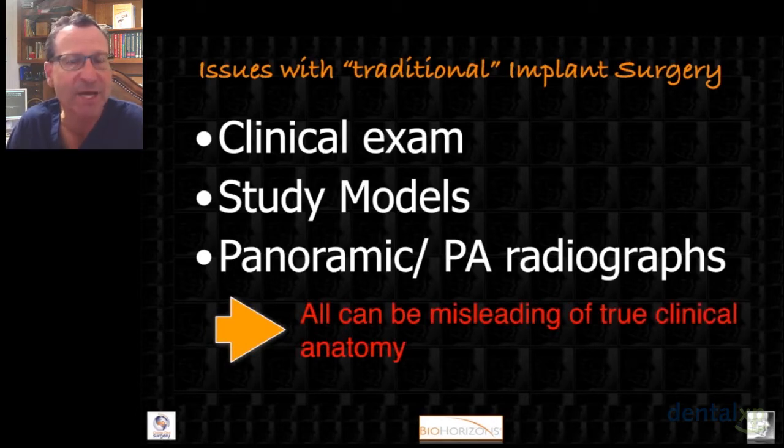How many times have you had a surgical guide available from a study model and you had the implant placement, the positioning all set through the center of the occlusal table of the pontic in the wax up or in the surgical guide, and you flap it open and you realize that you can't place the implant in that position, and so you need to move the implant generally a little bit more lingually or palatally in order to get the implant in good solid bone.